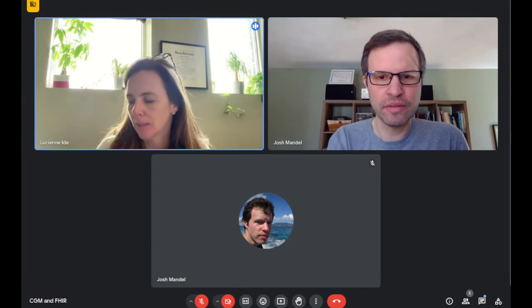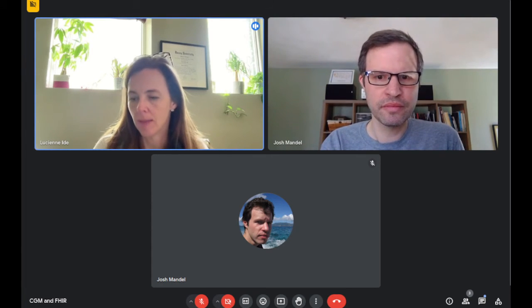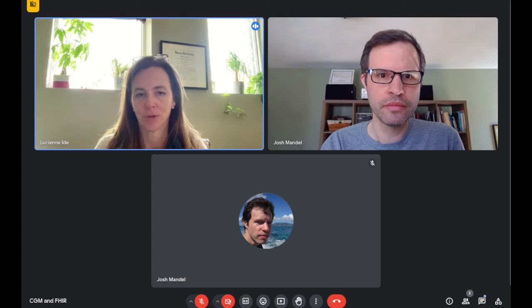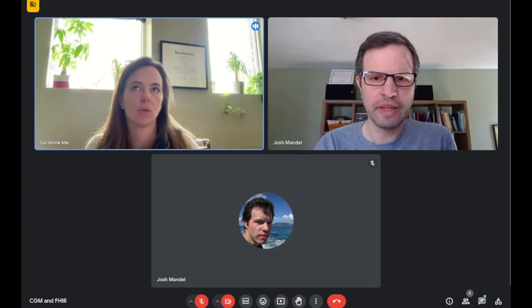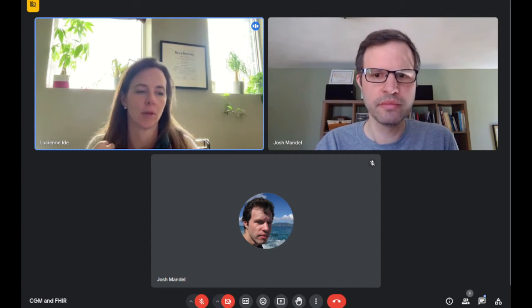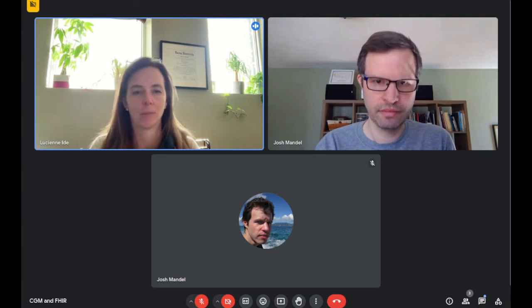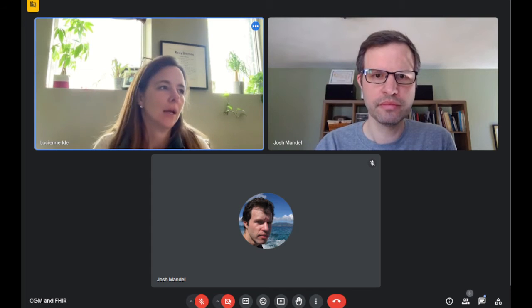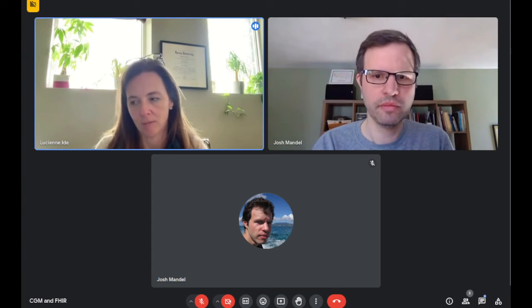And they have done some automated matching on multiple criteria to try to capture those patients who already have an account. Not a new start, but can they match first name, last name, date of birth from the EMR to first name, last name, date of birth in a system like Libre. And there's going to be a percentage automated match and not. We have multiple devices, not just CGM, with this same workflow.